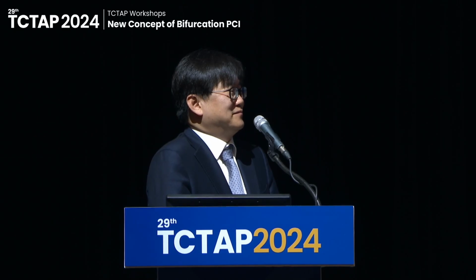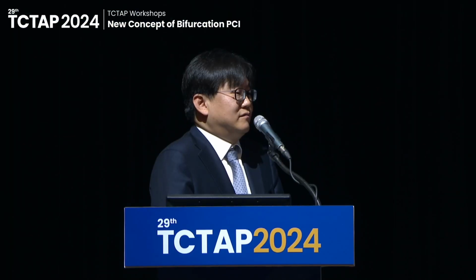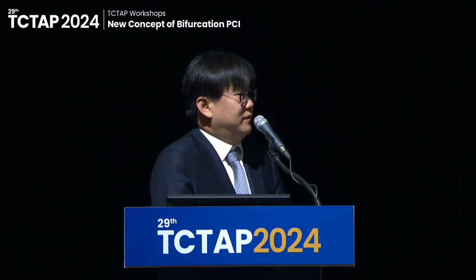But in your practice, just tell me roughly what you would do. Do you image after predilatation routinely? Yeah, sometimes I did the imaging two, three, four, five times to check the full dilatation of the stent, or check the lesion preparation first, and after stenting, and after high pressure balloon dilatation, and final surveillance. At least three or four times imaging surveillance during the left main PCI.